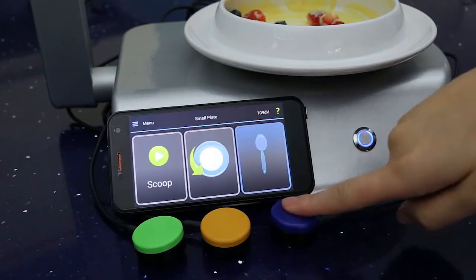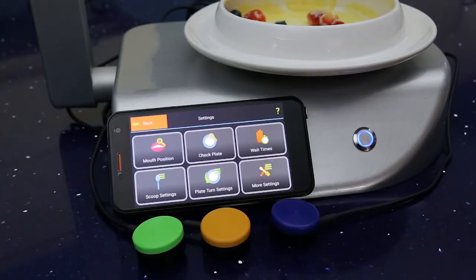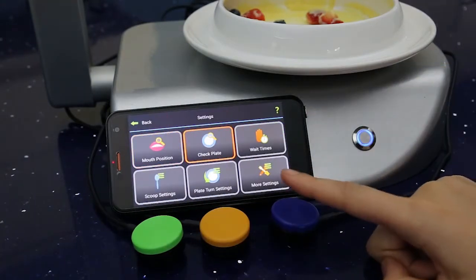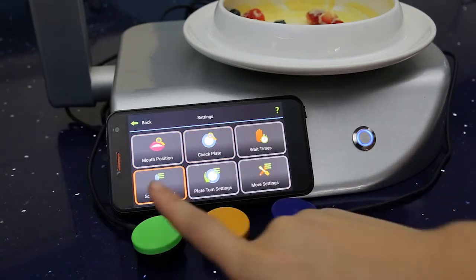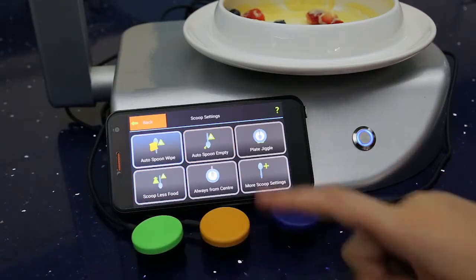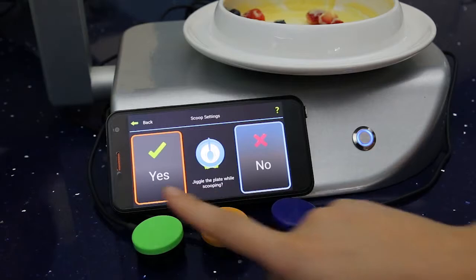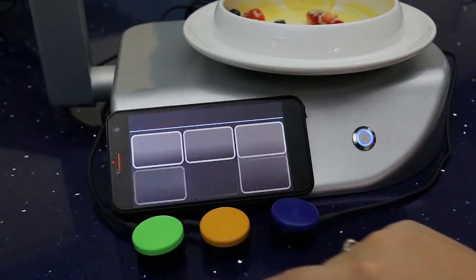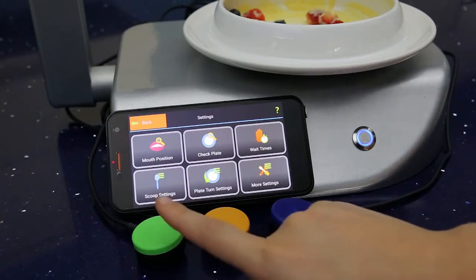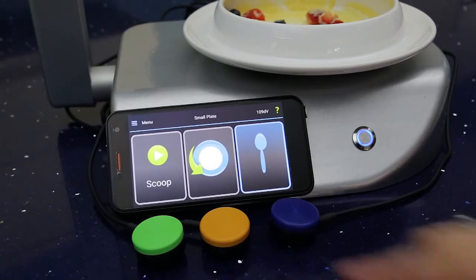And then when you press and hold for a really long time, the menu comes up, so you can select it using the green one. And you can navigate forward through the menu and backwards using alternative switches. And then you click the first switch as your select. So if I'm changing the scoop setting here, I would like to set plate jiggle because I have some sticky food. I can click select, and then head to back, and then back again. And that setting has now been achieved.